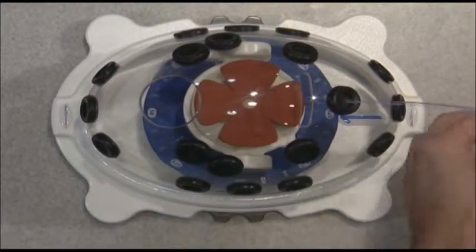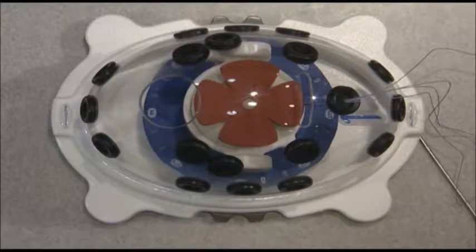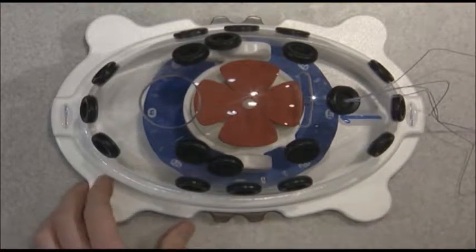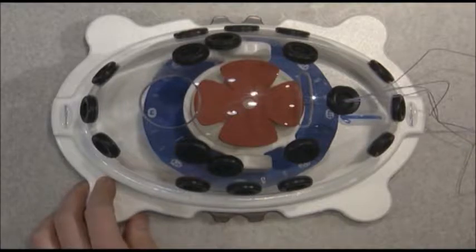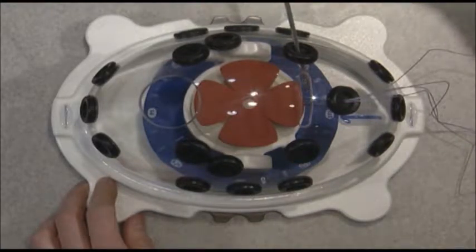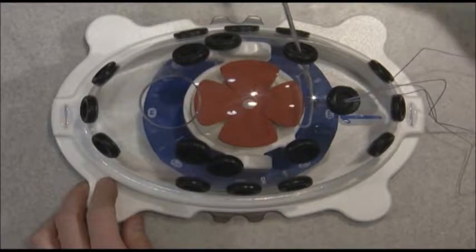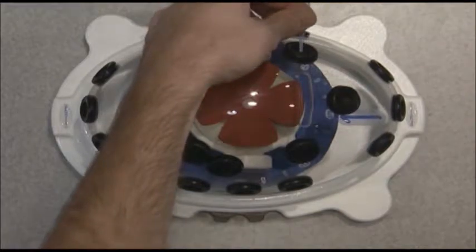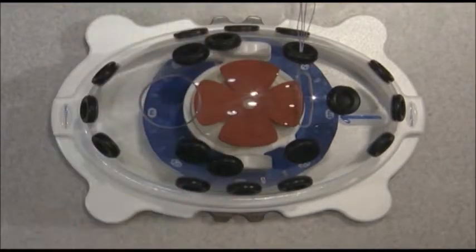And we'll pull our insert out and release our sutures. This suture anchor is double loaded. Double loaded means that it's loaded with 2 strands of sutures. Because I'm going to be passing another anchor into this area, I'm going to retrieve these sutures out the anterior cannula. This will keep my visual field clear while we're doing this arthroscopically later.